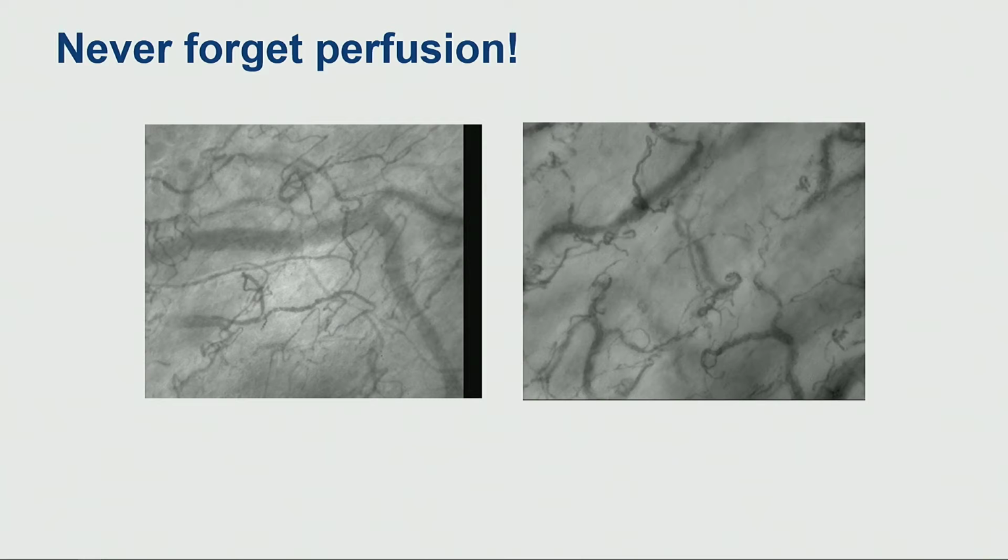I can spend a full day talking about it, but I want to show and share these with you, and I've got my fellows in the audience, and they've probably seen this because I show this to them when I talk back home. But a healthy microcirculation and a microcirculation in a patient on 3 vasopressors. Both patients are at a MAP of 65 or beyond. And I'll try and play these clips for you if I can.